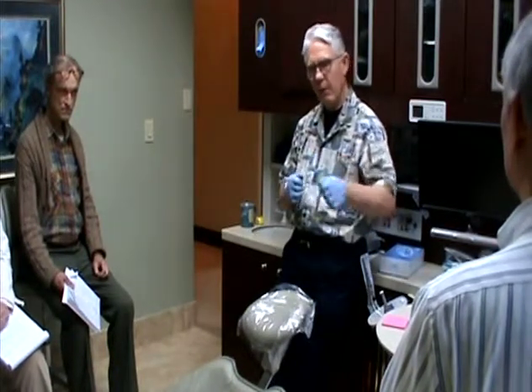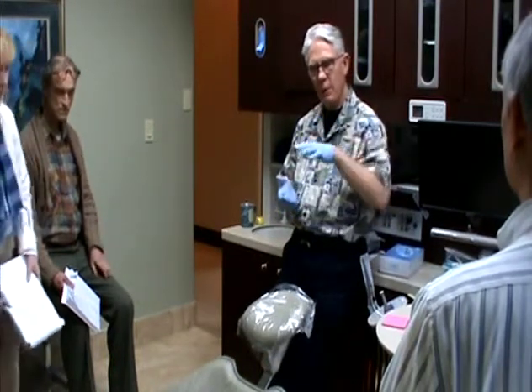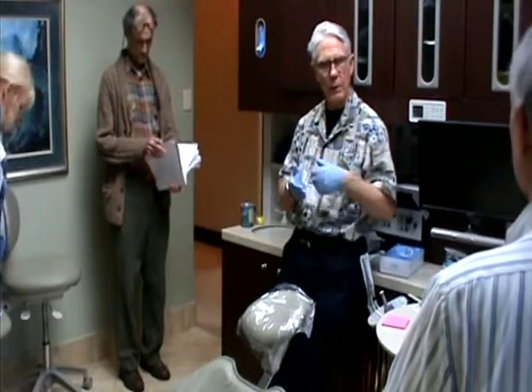especially when you're gonna go from Super T to composite. Then you can go in there real quick, grind off your Super T as much as you want, put some composite on there, close the thing down, put a little extra bonding agent on the top of the teeth, tap them in a little bit, and then close it and set it while it's closed.